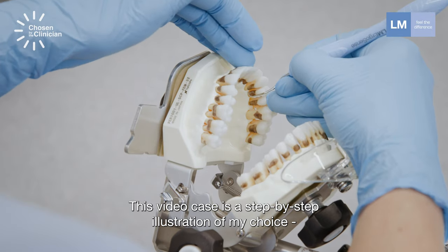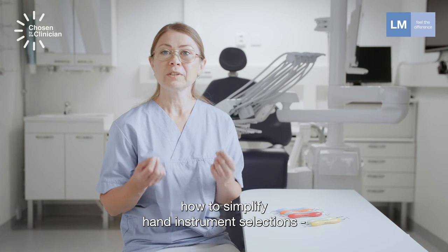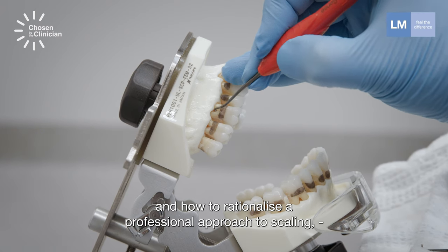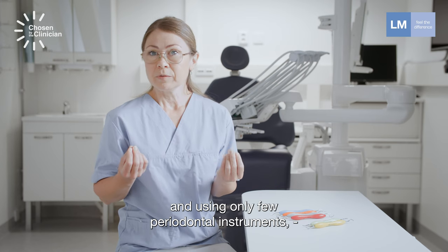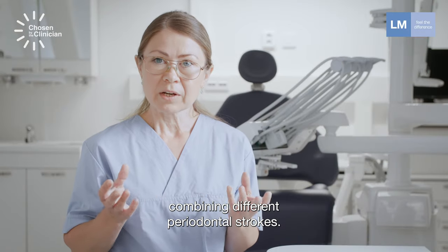This video case is a step-by-step illustration of my choice — how to simplify hand instrument selection and how to rationalize a professional approach to scaling, making it more time-efficient and using only a few periodontal instruments, combining different periodontal strokes.